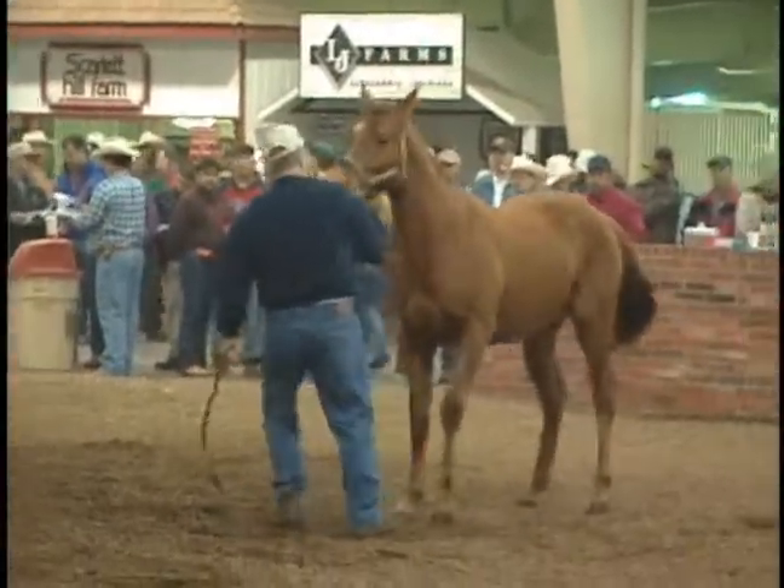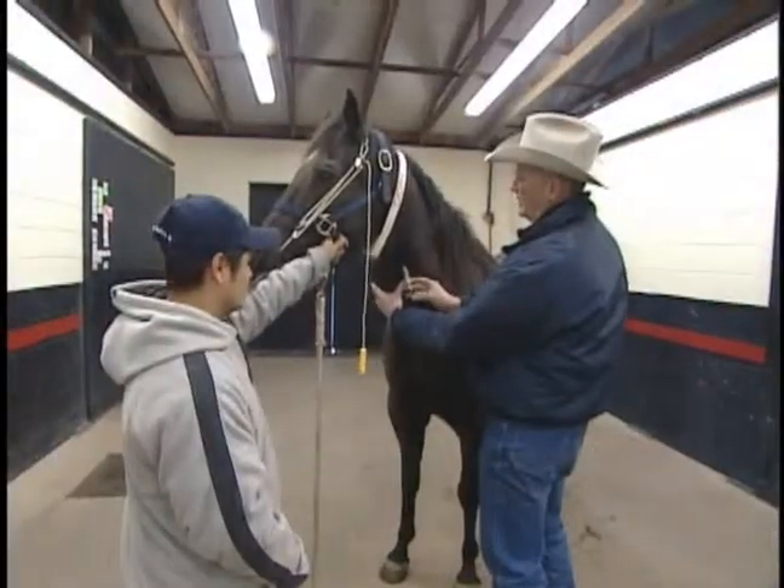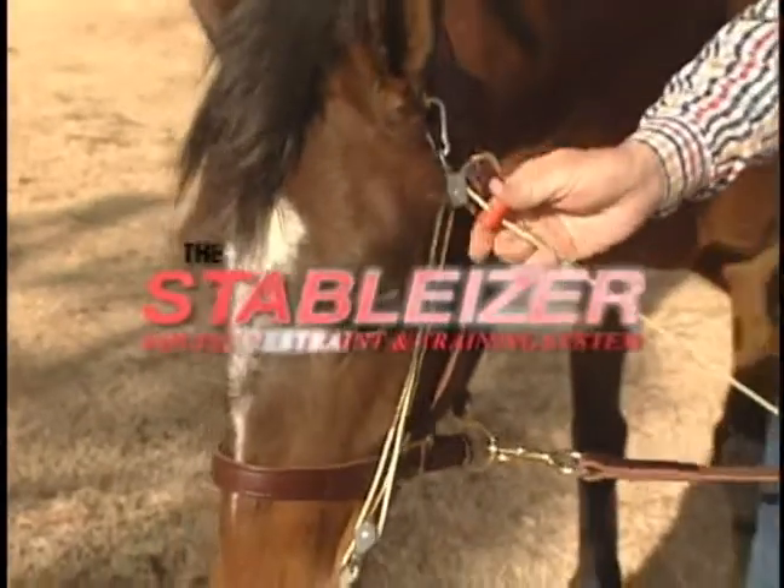If you own horses, train horses, breed horses, compete in equine events, or practice equine veterinary medicine, you need the Stabilizer Equine Restraint and Training System.